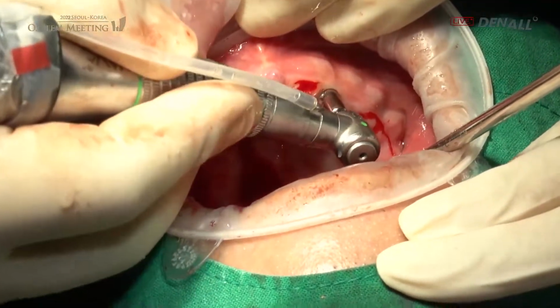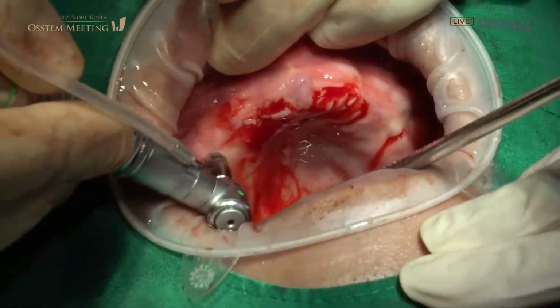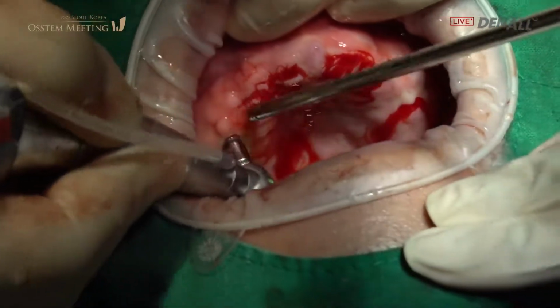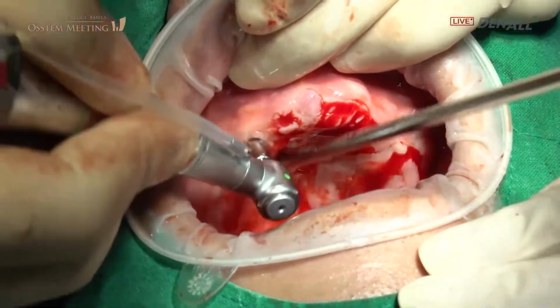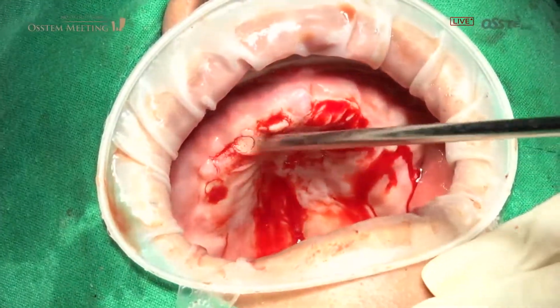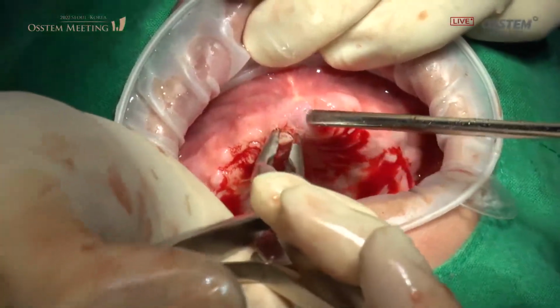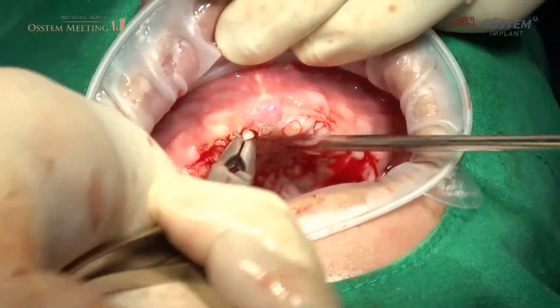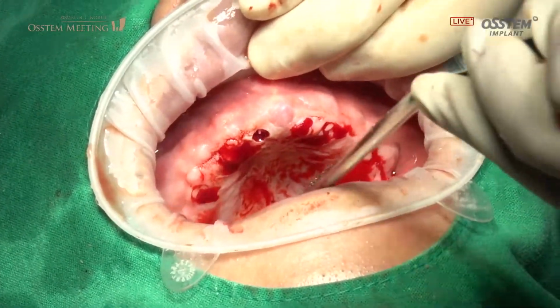Once again, the tissues are removed in this process. So using a tissue punch, the tissue is removed.